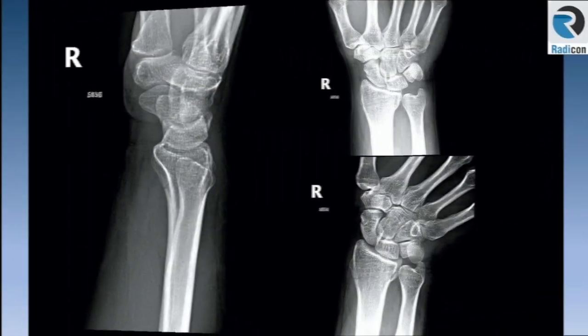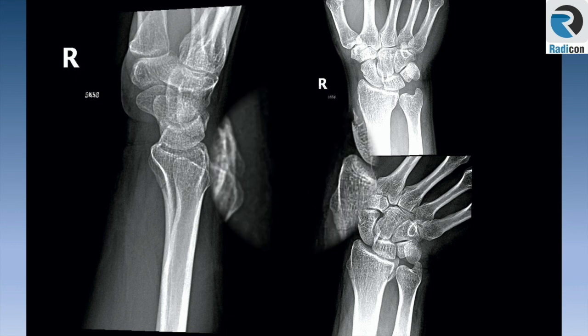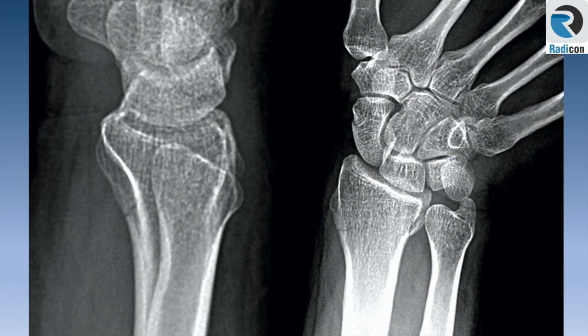Case 13 is a wrist film, unilateral, so likely trauma. Let's zoom up and it shows an undisplaced fracture of the distal radius.